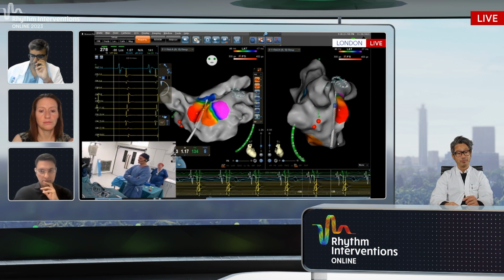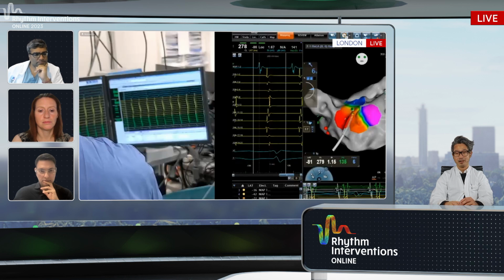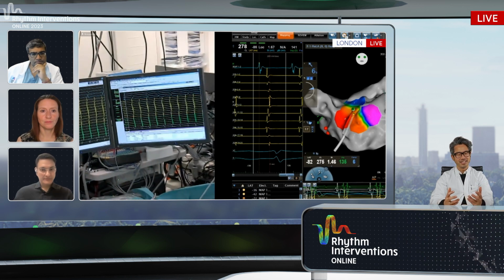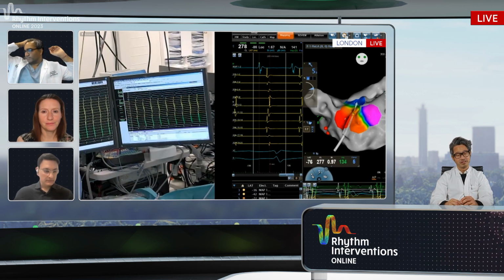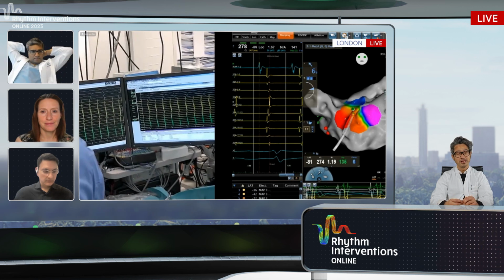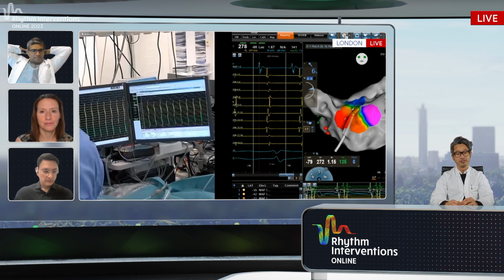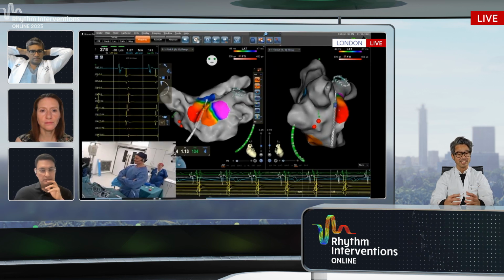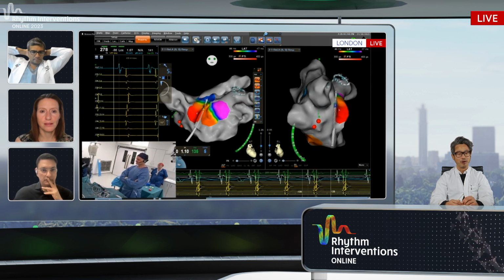But still, I would like to ask now maybe Claire, ladies first. Claire, in your typical workup on this not too uncommon clinical problem, would you, number one, expect also typically a macroreentrant mechanism? And what is, in your experience, the most likely type of arrhythmias, and how would you tackle that?